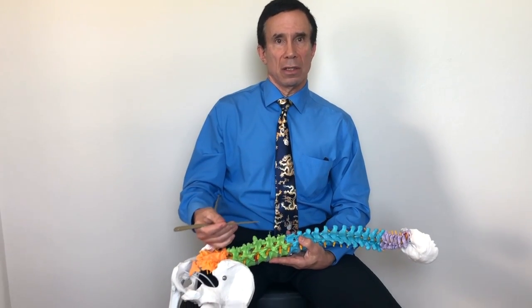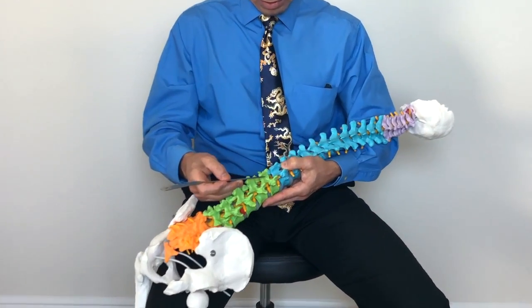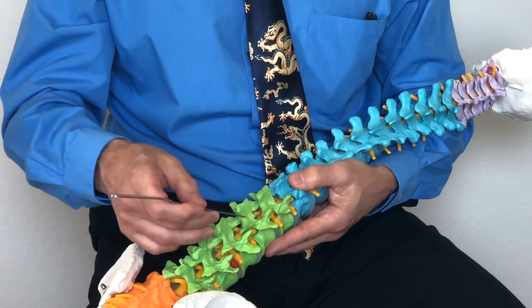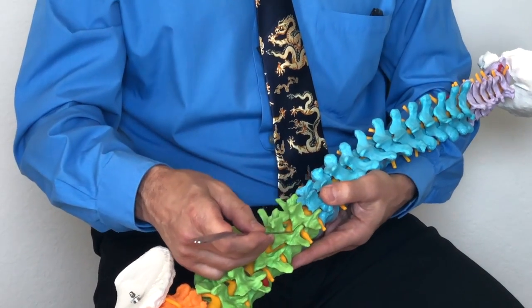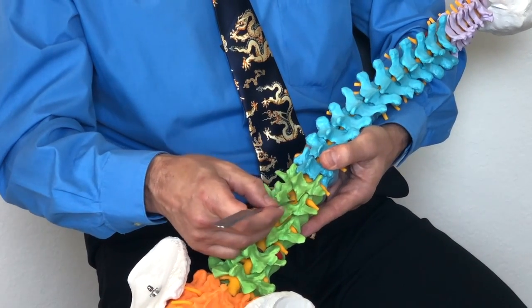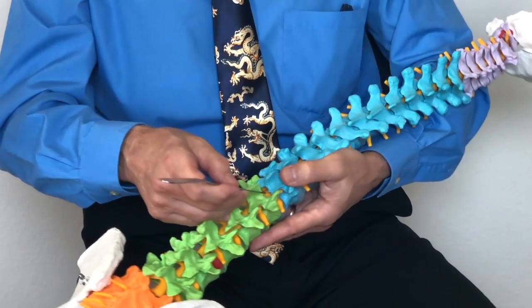In a trial of spinal cord stimulation, a specially designed needle is used in order to gain access to the spinal canal. For a low back or leg problem, the usual site of entry is down here at L1-2 or sometimes here at T12-L1.